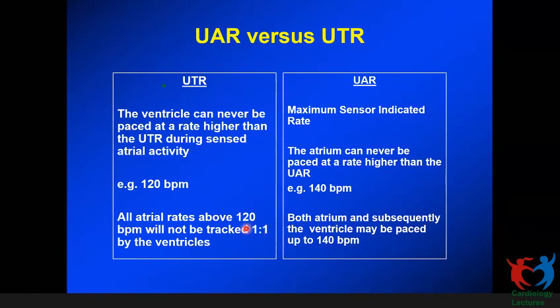ventricle. When the sinus rate becomes faster than 120 beats per minute in this case, up to the TARP rate, it will provide Wenckebach, and beyond that, it will go into a 2:1 pacemaker block. That is when it is sensing the atrium.